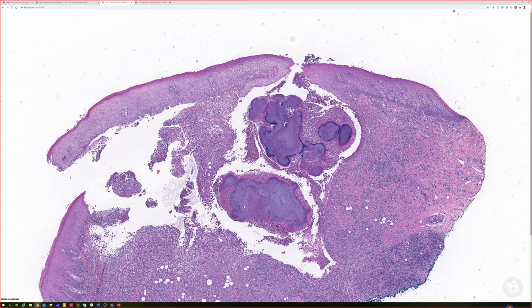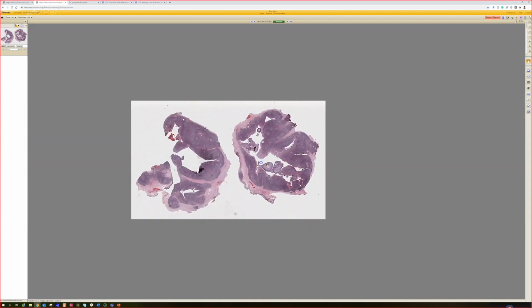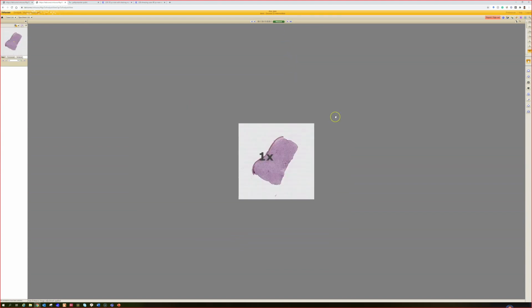Eumycotic, eu means like true, basically. True mycotic mycetoma is actual fungus making a ball-like structure like this. And the one other thing that you can have, we'll talk about later because we have a case of it here to look at today. So this was actinomyces in a tonsil in this case. Okay, 11.